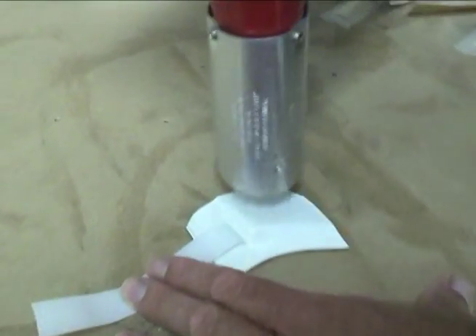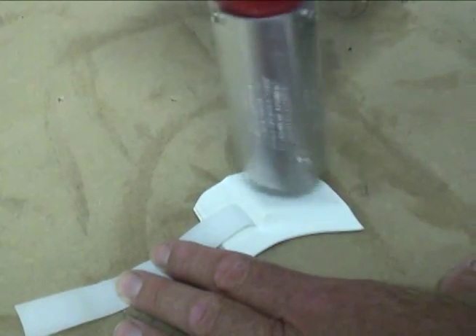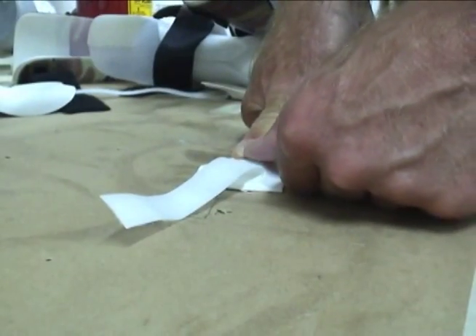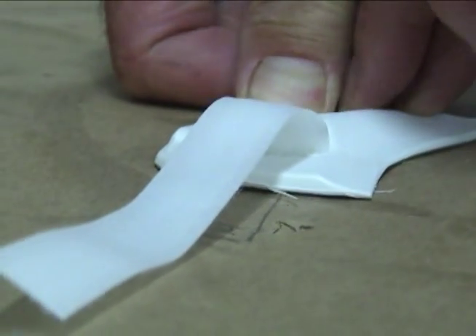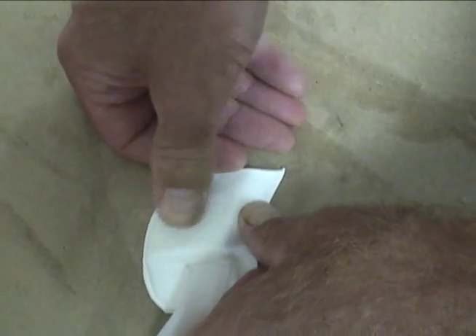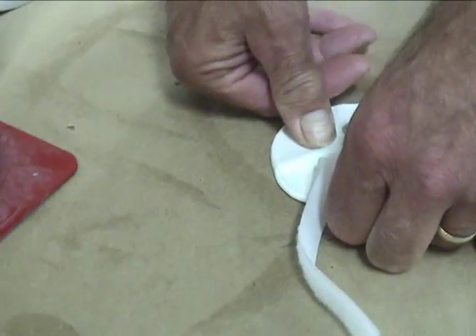You'll see me adapting the toe rise by heating it with a heat gun, which actually makes it soft. I then shape the softened foam with my fingers to fine-tune the shape of the surface under Austin's second, third, fourth, and fifth toes.